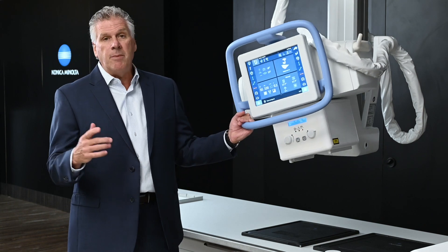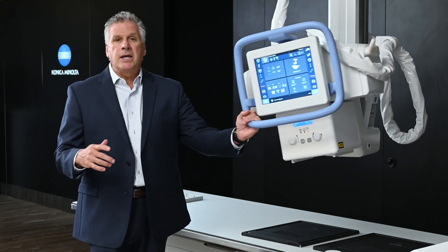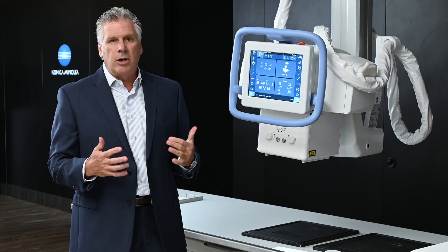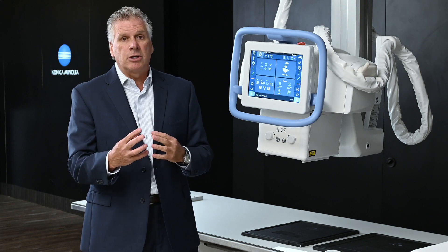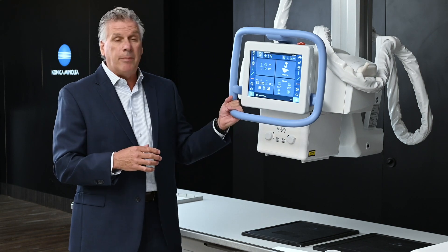First and foremost, we've created a manual overhead tube crane. I can grab and go at any moment in a room — very useful in an ER setting. There's a lot of things going on; cart patients are coming and going, so we have a grab-and-go feature.